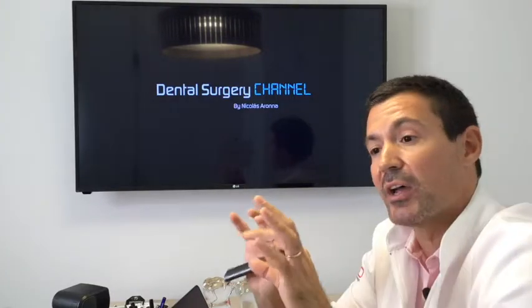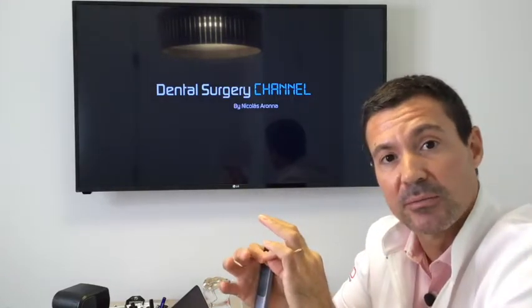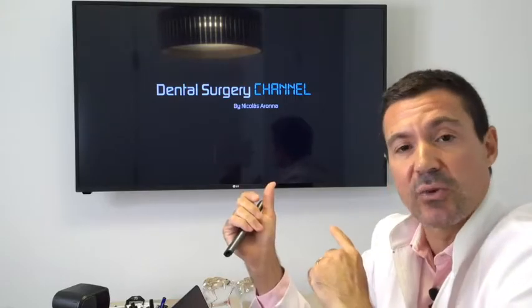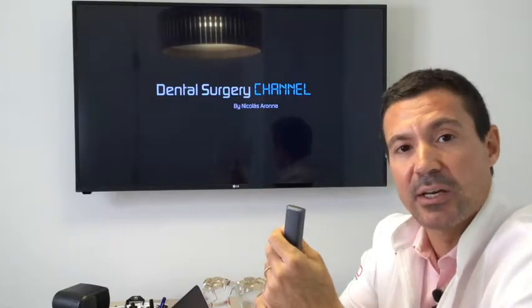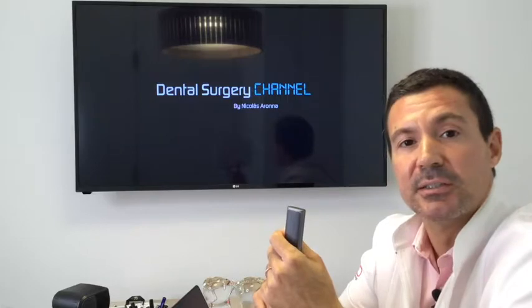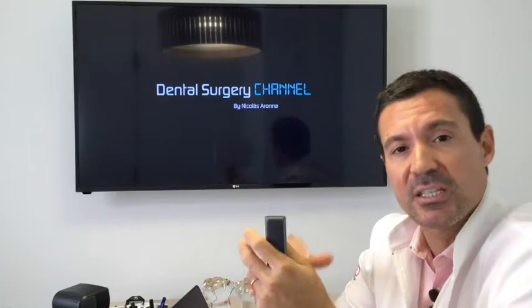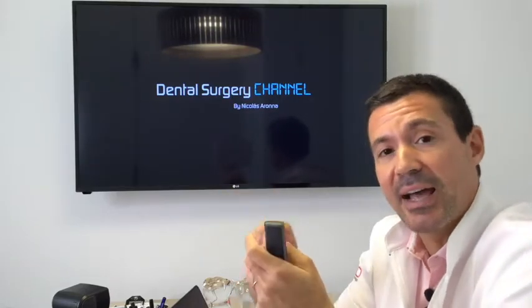So in this case, the patient didn't want to go for the second implant to try to re-screw the second implant, it's something that we need to communicate with the patient. I'm not finishing my job, and it's very important for you to know it. And another thing, if you hand tight that screw and you take an x-ray and you feel the block of your screw, and there is still a misfit, do not apply 20 newtons torque, because you might break the structure of the implant, the platform, you might break something, and especially a screw that has been suffering. So what we did was hand tight.